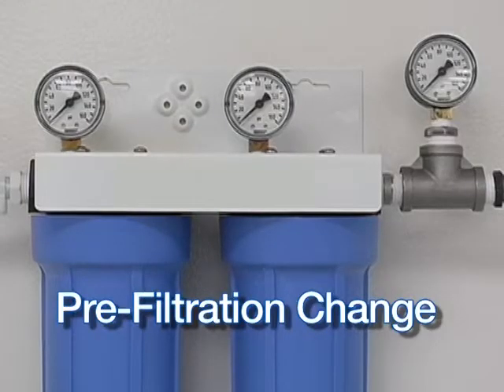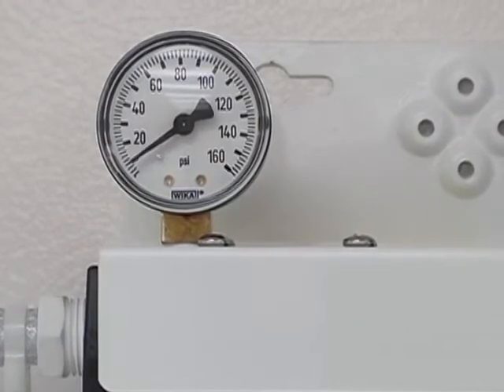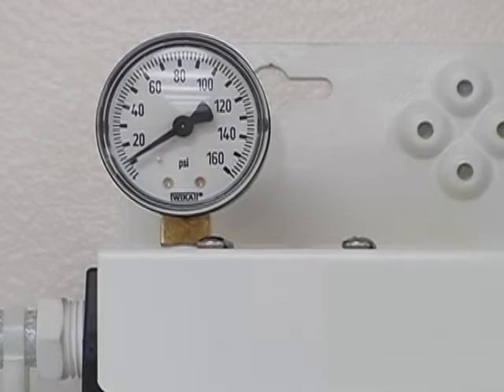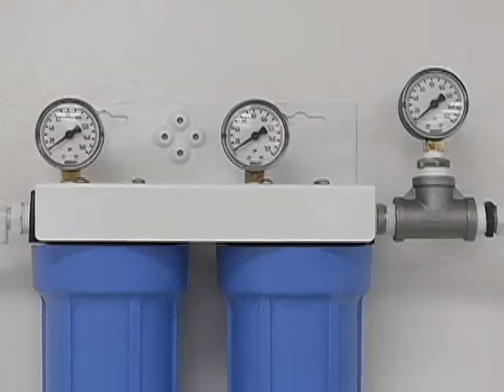Water quality can vary geographically, seasonally, and intermittently, depending on a variety of factors, which will affect filter life. Saturation of the filters with sediment will cause the incoming water pressure to drop below the minimum 40 PSI requirement in the DSD-201's flush cycle. When this occurs, the difference in pressure between the gauges will indicate which filter must be changed.